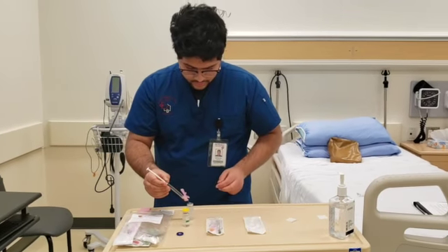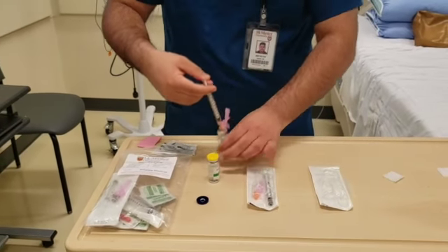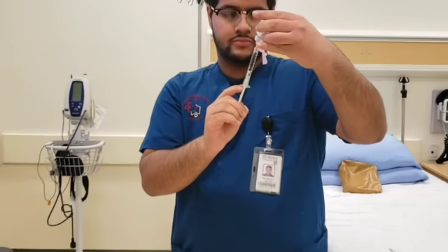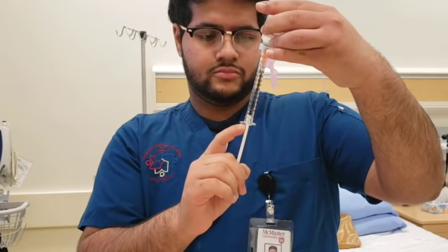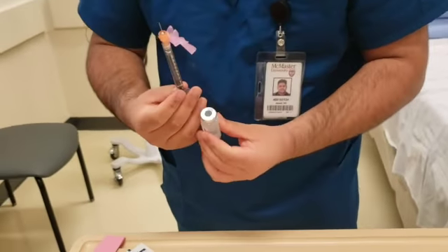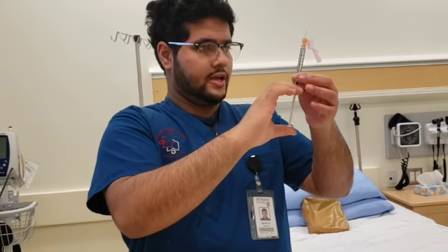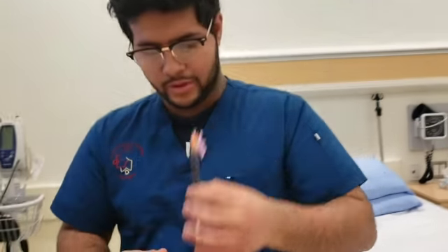Remove this. We're going to aspirate this so it just makes it easier for the heparin to come back in. Turn it upside down. I drew a bit more than 1 milliliter because there is an air bubble on top. So I'm just going to flick this until the air bubble goes away, and push this on top. And it's perfectly 1 milliliter.